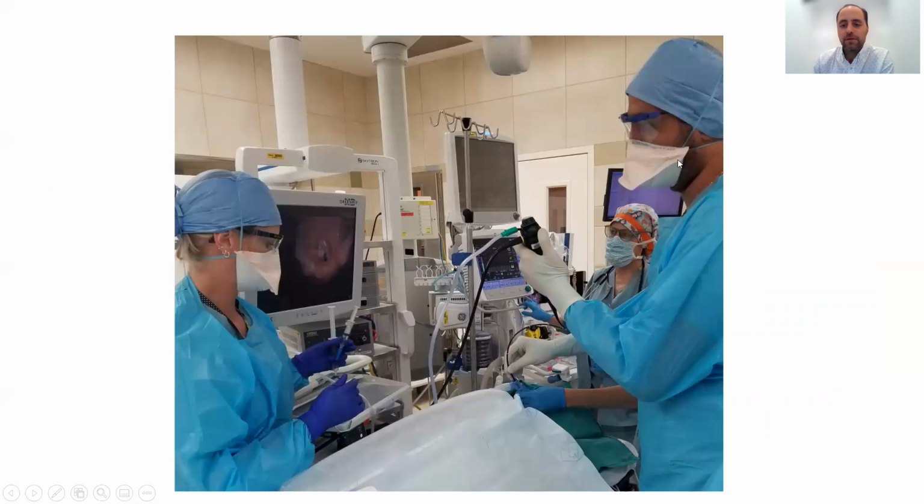This is an example of one of our current fellows performing a bronchoscopy with his dominant hand on the tip of the scope, inserting it into the swivel adapter, and his non-dominant hand controlling the extension flexion control and his index finger on the suction on the opposite side. You can also notice that members are wearing full personal protective gear with eye coverings and masks.